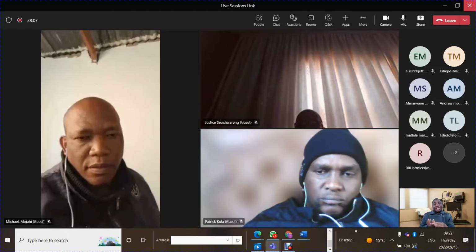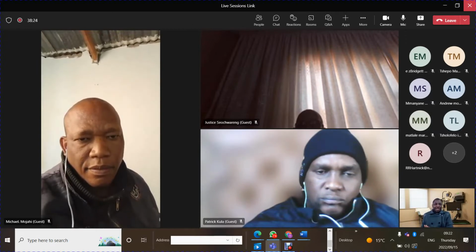So the more oxygenated it is, it impinges on how much of that light can go through, right? And how much of it can be picked up on the other side before the signal is amplified and processed, and through the algorithm that has been built into that system, it translates into figures that we can see and say, okay, this is 94% or 98% of oxygenation in the blood.